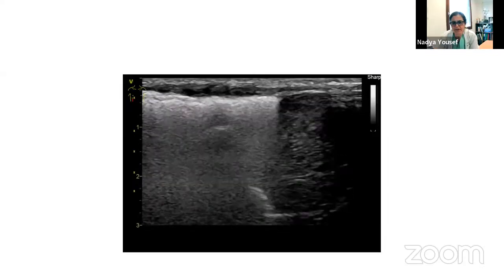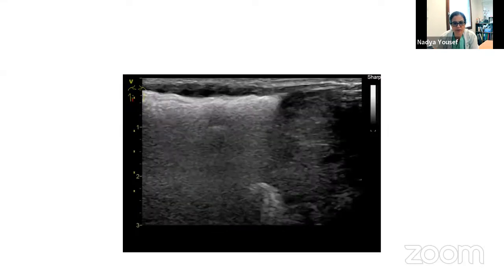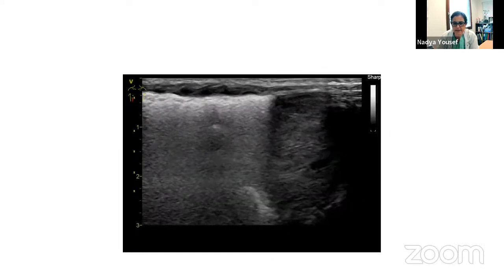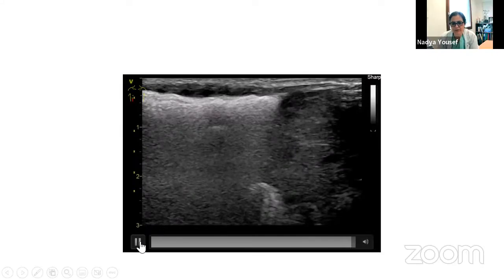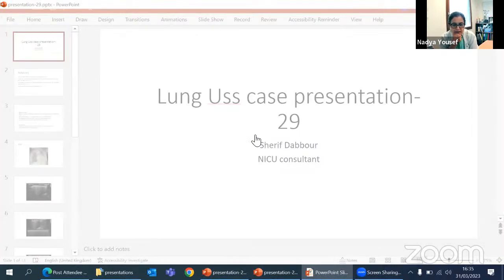What I really like is that you've identified that we know it's the lung and there is movement, sliding. I do agree with you that the lung surface, the pleural line, is thickened and irregular. It's an 8 megahertz probe, so of course we're seeing the images blown up. I guess it's the liver here on the right side of the screen. Right? Yes, correct. I don't really know what we're seeing here, and you'd have to move the probe around for this area where you were asking, is it an A-line or is it not? It might or it might not be. Only you would know when you're actually rescanning, maybe moving your probe to vertical, horizontal to get a global overview.